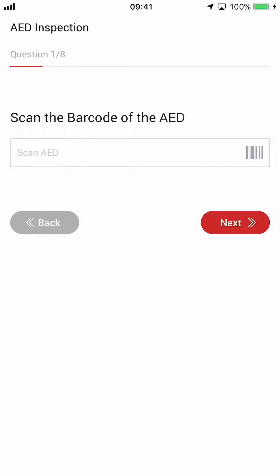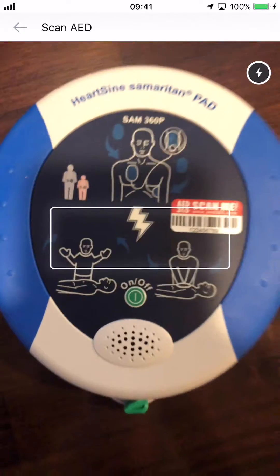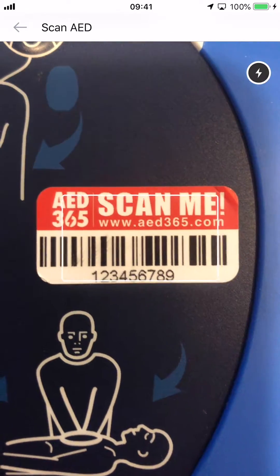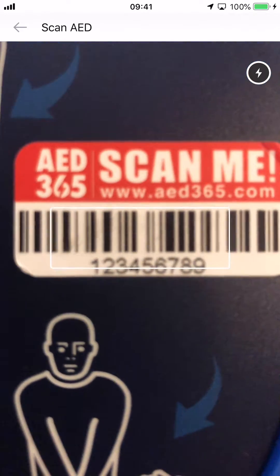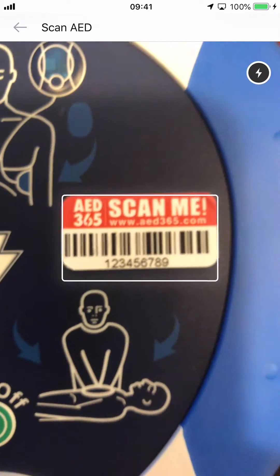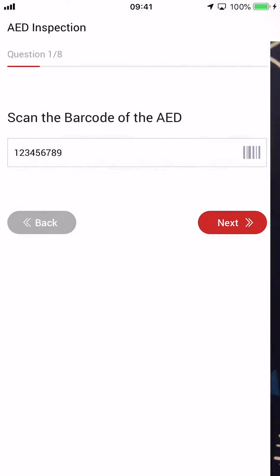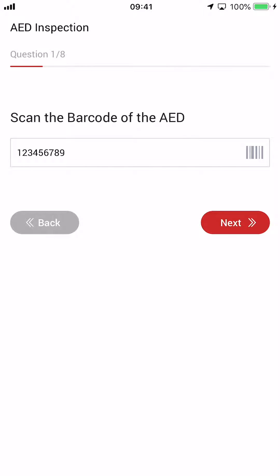Next, tap the barcode icon on the right side of the text field to open the in-app scanner. Find the AED365 Scan Me label located on your AED and hover your device's camera over the label. As soon as the scan is complete, the barcode number will populate in the text field.